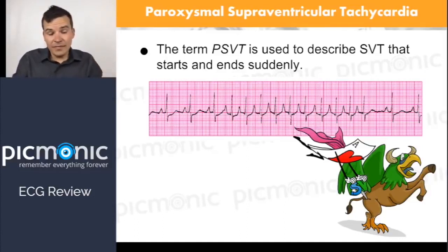That's okay. That's way too fast. But is it regular? Is what's going on here regular? Well, I'm going to get my beautiful thumbs and I put them up there and I look and I'm like, wow, I got a big space. So I hear, oh, there we go. There's my red pointer. I got a big space. I got another space the same. Then it gets smaller, smaller. But then it's just literally just tiny space.